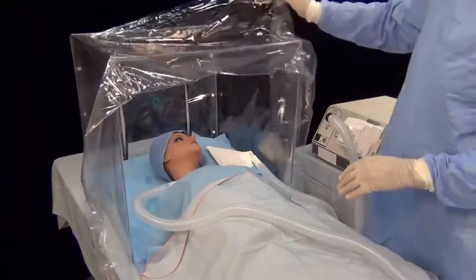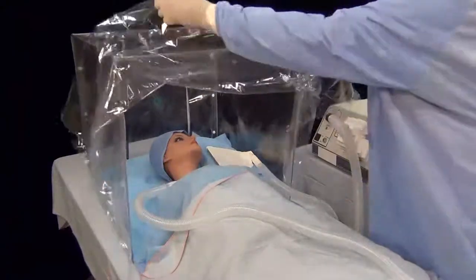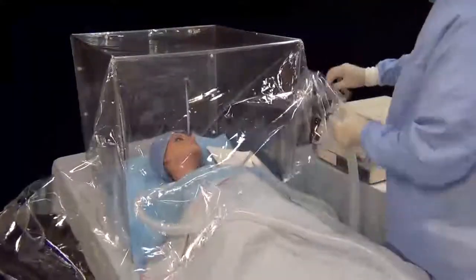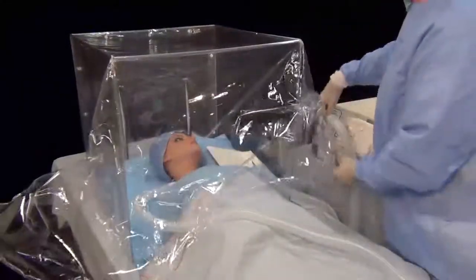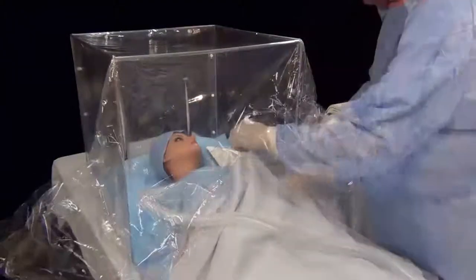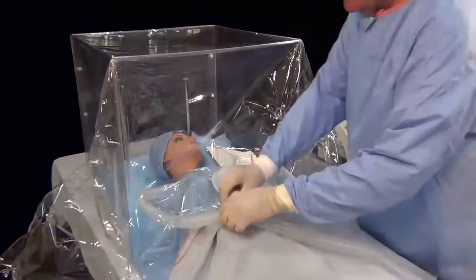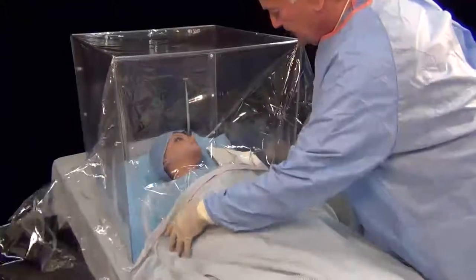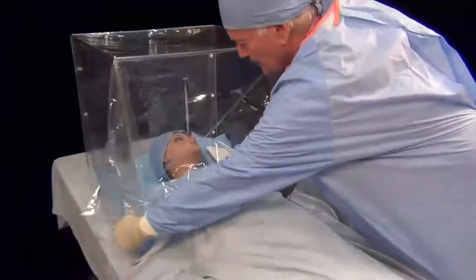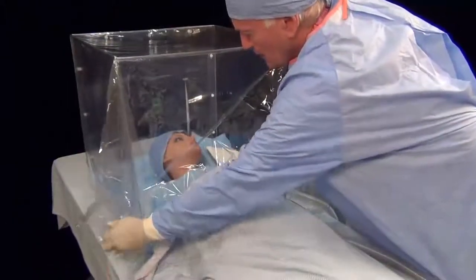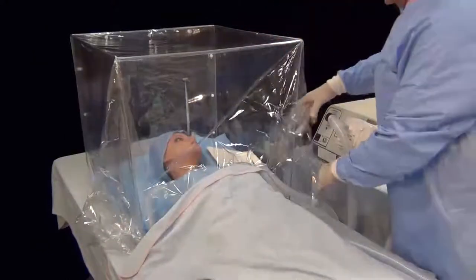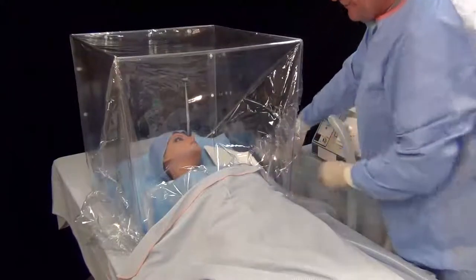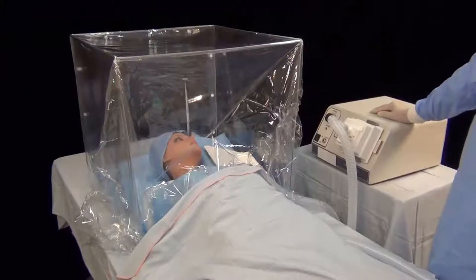At that point, with everything now set up, we now complete the patient isolation by bringing down the clear plastic flap. You'll just cover all this over with the blanket that is covering the patient. All the tubes have come out through the bottom of the flap. And we are now ready to proceed to intubation.